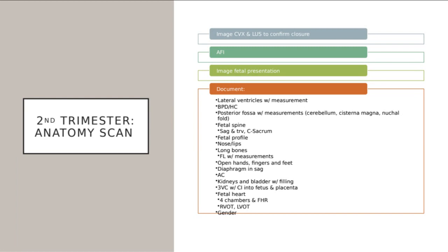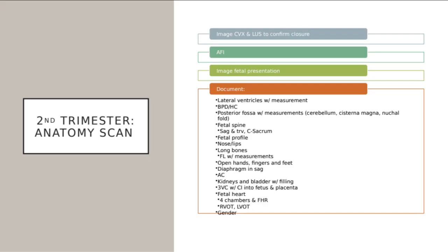We're looking at our fetal spine. We're doing sag and transverse pictures. We're going from our cervical spine, about our neck, all the way down to the sacrum. So we're doing cervical, thoracic, lumbar, and sacrum, both in sag and transverse. In sag in particular, it's important for us to show the nice skin border along that baby's back to make sure that there are no defects in that soft tissue. In transverse, we're looking to see those three pronounced ossification centers.